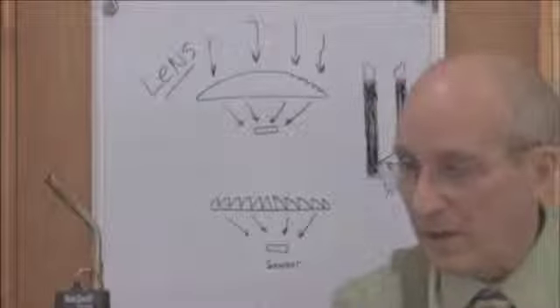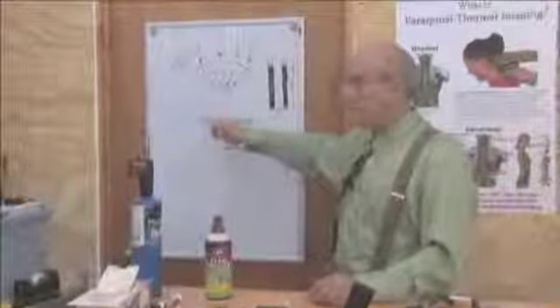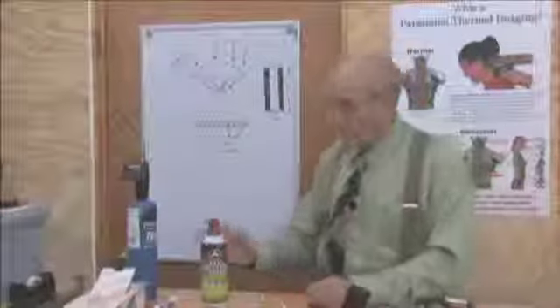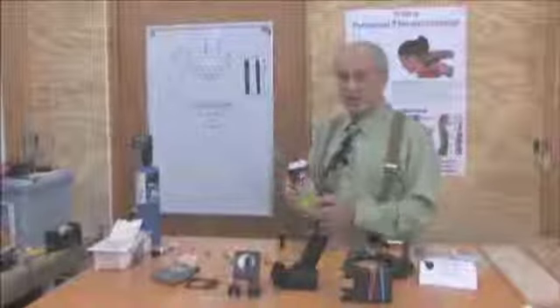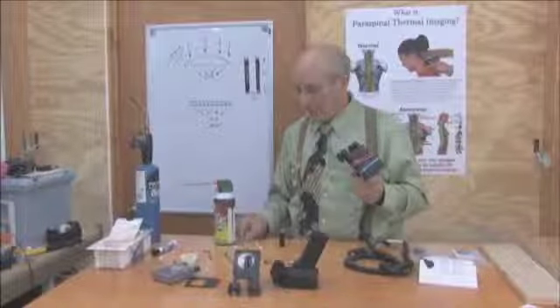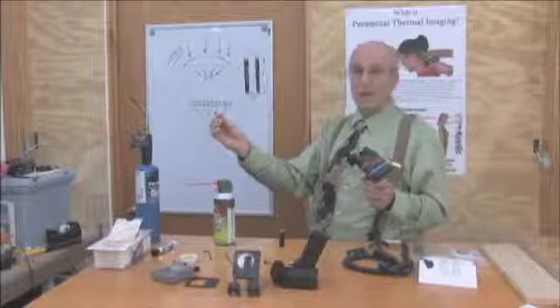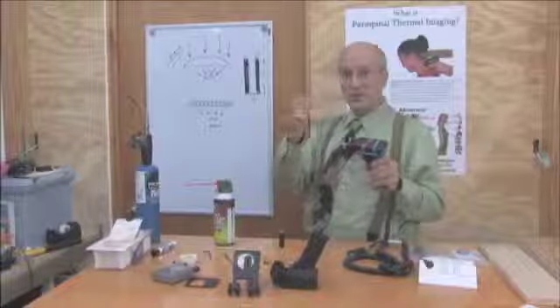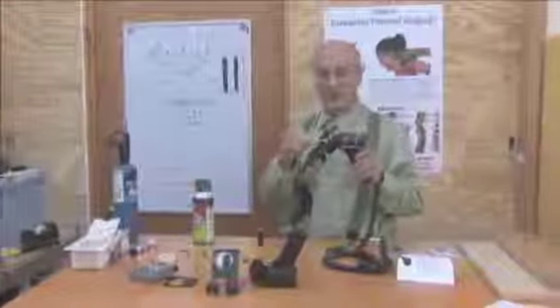When you clean a scanner, the last thing that we want is for you to push any debris down into those grooves. That will reduce the sensitivity of the scanner, and we'd have to have it recalibrated. It's very useful to have a spray can, a little dust buster like this, and do a check of your scanner. The very first thing we do is I mark a Q-tip, and once you've seen one once, if you hold the Q-tip about there, you can't go any further than 2 inches in. So I go down the center of the barrel without touching the walls, and I flick out any dust or debris that may have accumulated in the lens.